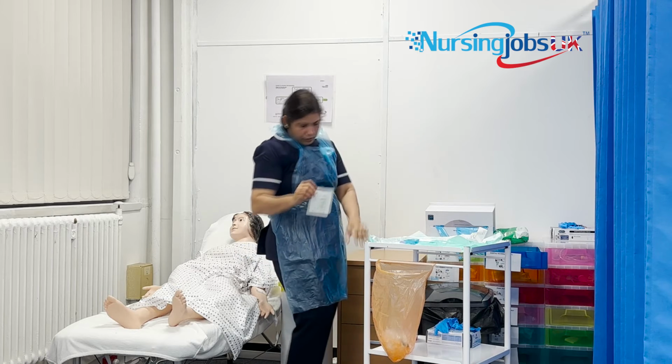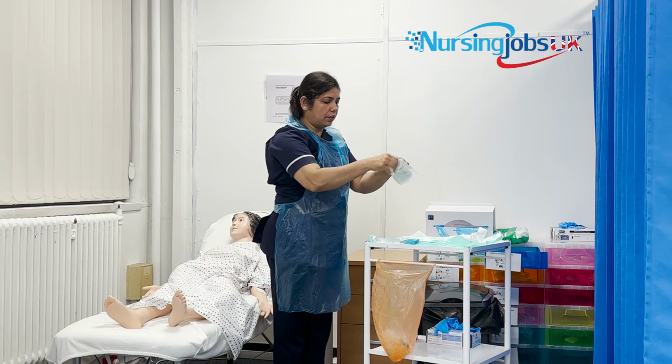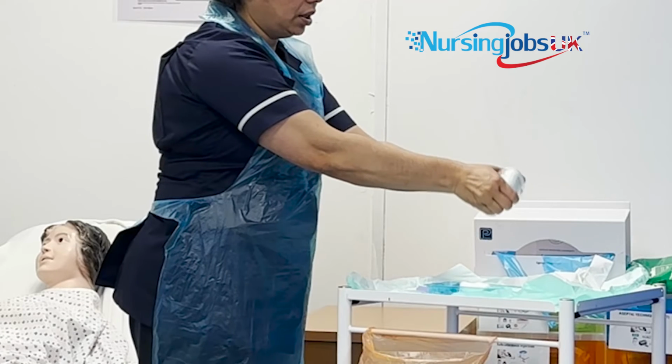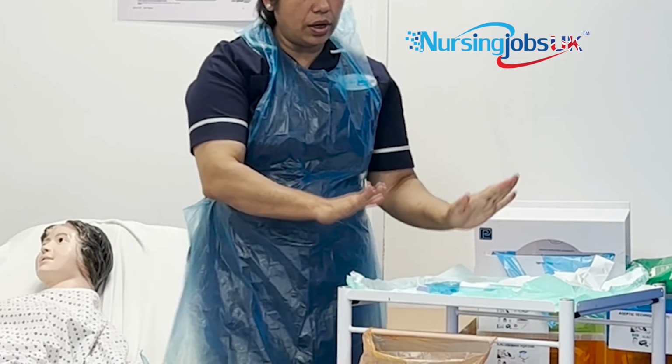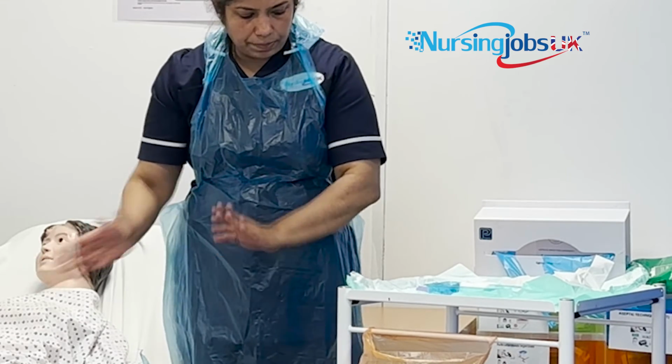Now the last one from your trolley, that's your dressing. Always make sure, very carefully, open it and drop it. That's it. So now all your equipments are there. So now you can prepare the patient.